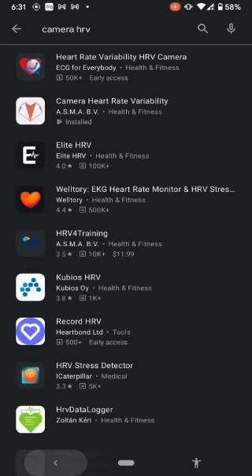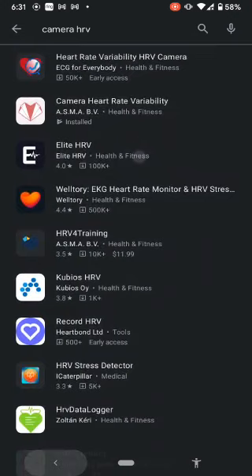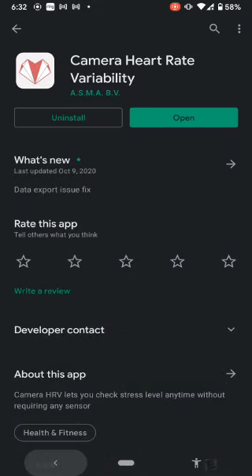You'll see Camera Heart Rate Variability and some other apps show up. The one we're looking for has a red heart with a white background that says 'Camera Heart Rate Variability by ASMA BV' — click on that, it's the second one. On your screen, if you haven't already installed the app, you'll see a button that says Install.